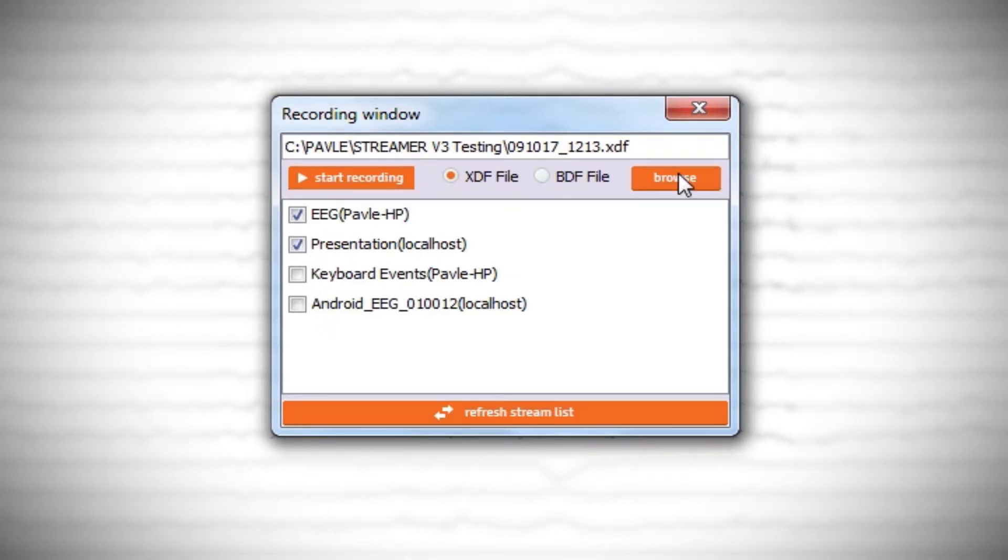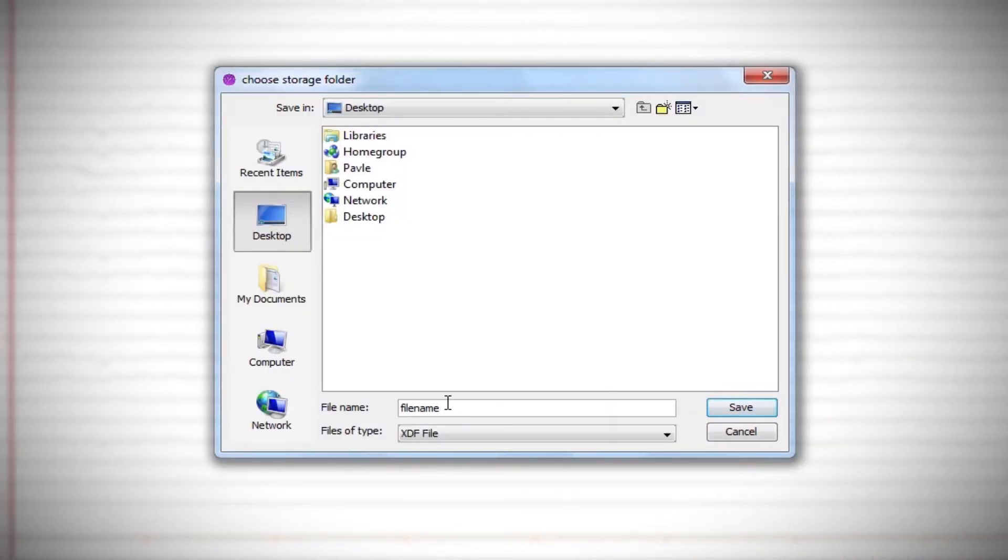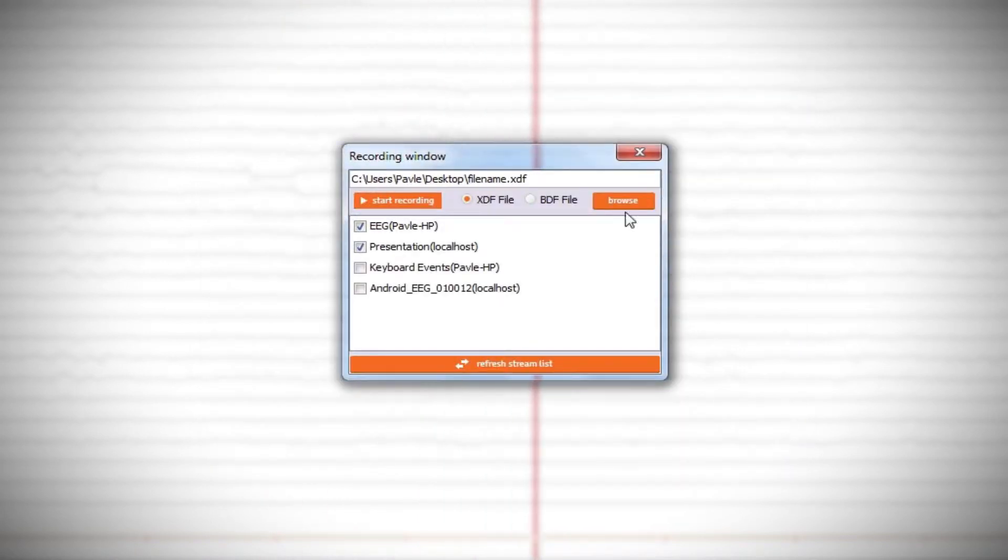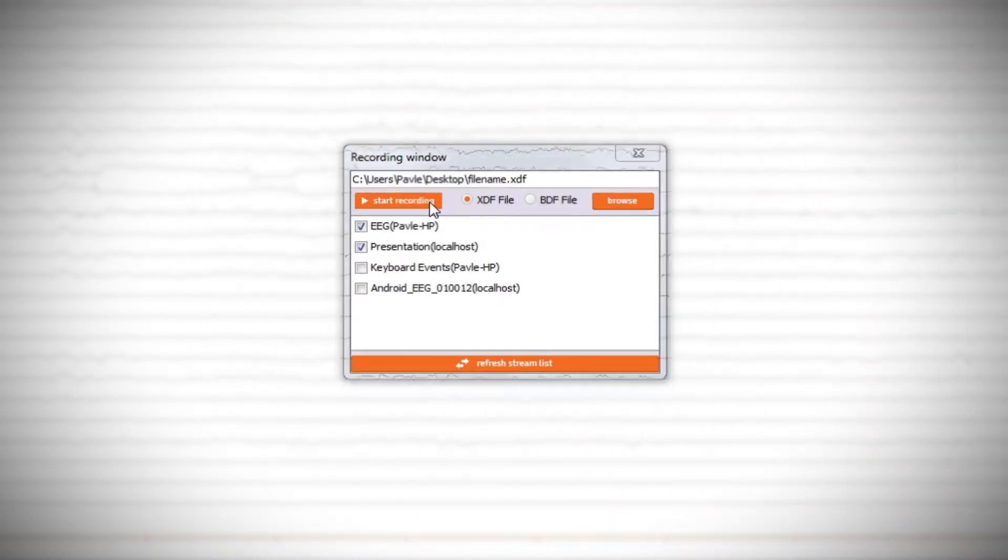Click the browse button to navigate to the folder where you want to store the data and provide the desired file name. When everything is set, click the Start Recording button.